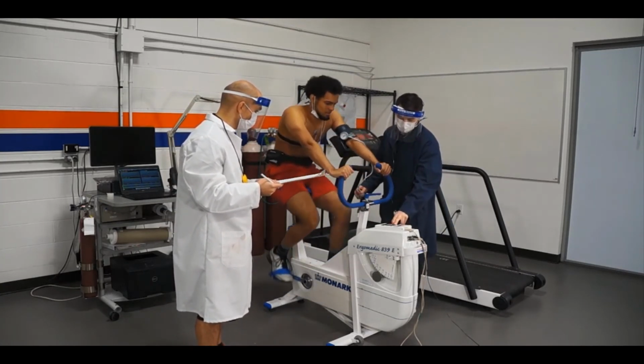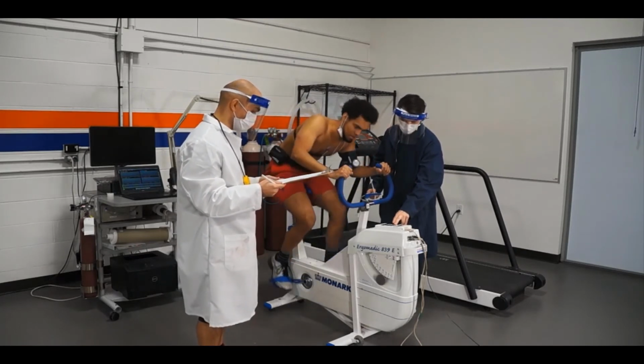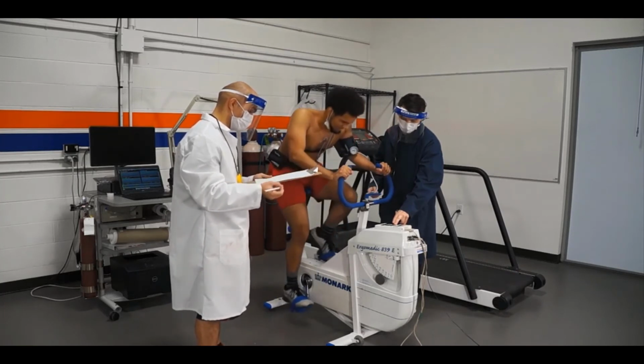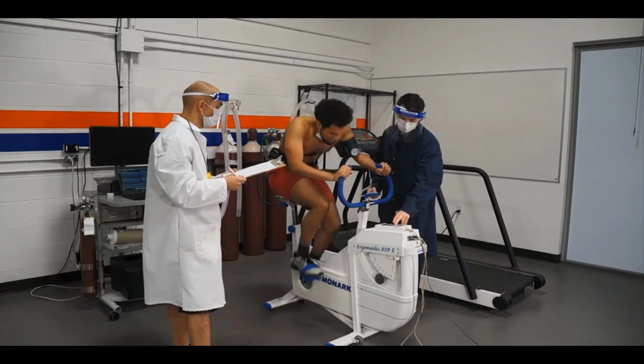So it's really just practice, and you can see here the participant was too fatigued to really keep it up, so we had volitional failure there, and run it back down into a cool down phase. And that's really all the indirect test is.